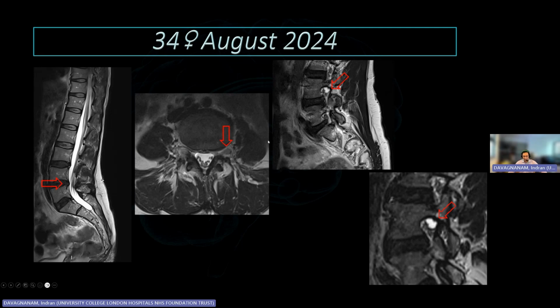But when you look very closely on the parasagittal views, you can see that there's a little meningeal diverticulum there. And you can zoom in on that on the high resolution sequences. You can see it there. And it's just adjacent to the nerve root. So could that be causing some mass effect? But clearly with the subdurals, one had to think about a CSF leak. But how do you tie both of them together?